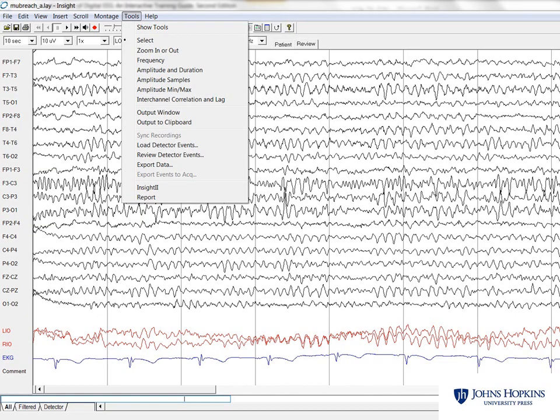The atlas incorporates a fully functional EEG reader that permits flexible filtering, scaling, and montage changes, similar to live EEG readings. This unique feature provides users with the ability to practice the types of file manipulation that will allow them to optimize pattern evaluation.